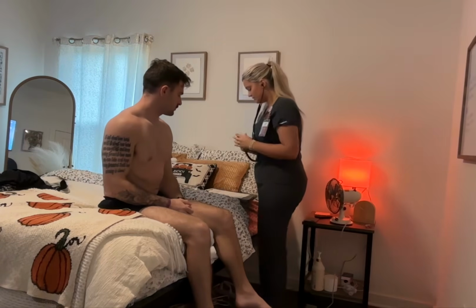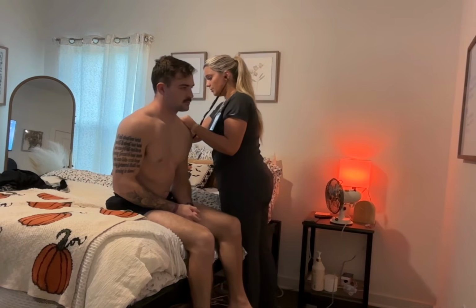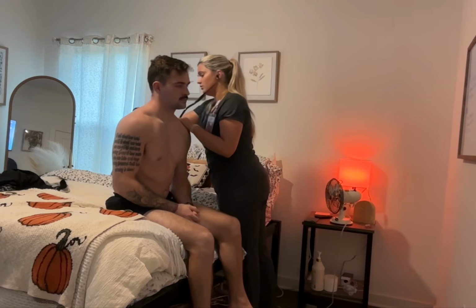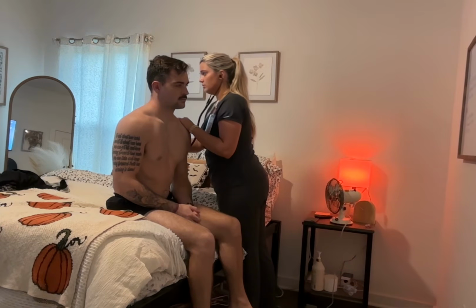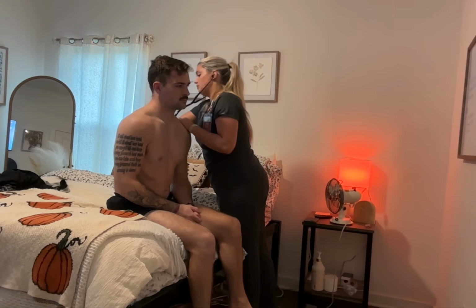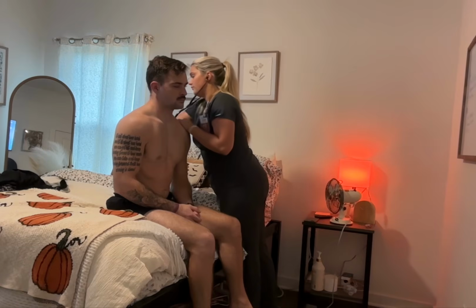Alright, so we're going to do the same thing on the back. Start up at the shoulder. So I'm listening for labored breathing or wheezing and going for the full lung space.